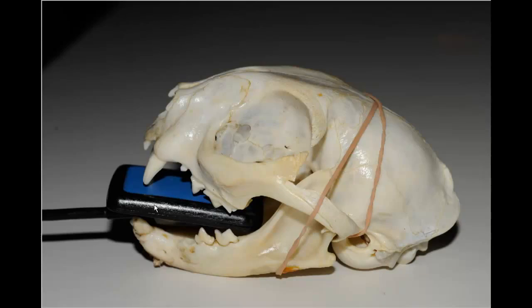At any rate, we're starting off putting the sensor in the mouth pretty much like a sandwich with the imaging side facing up, which means we will here be radiographing teeth in the upper arcade or the maxillary teeth.